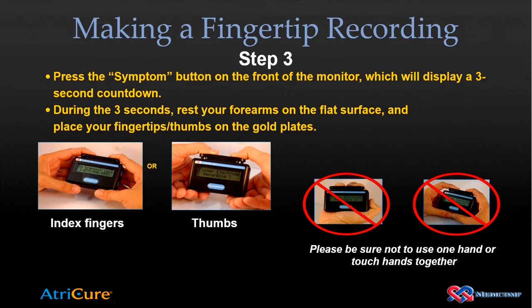As you see on this slide, the positions that are crossed out in the circles are not allowed. Neither of these hand positions will produce a proper ECG signal, if they do at all.